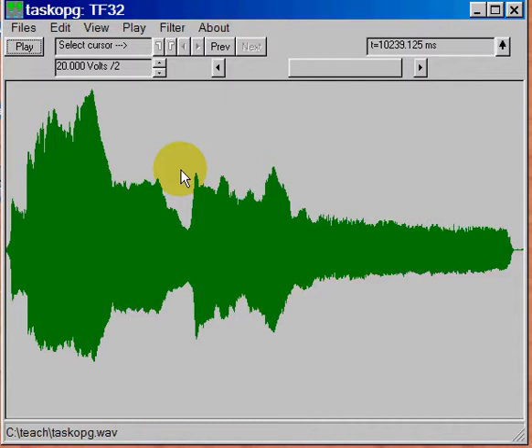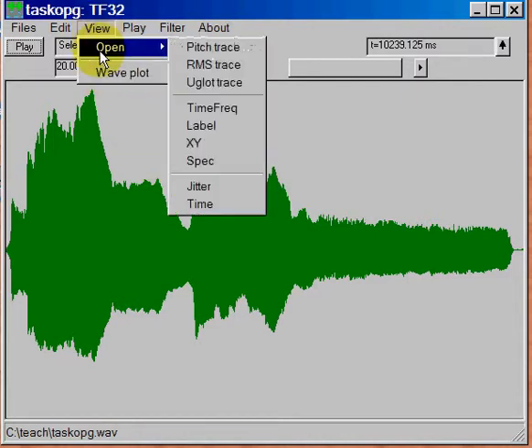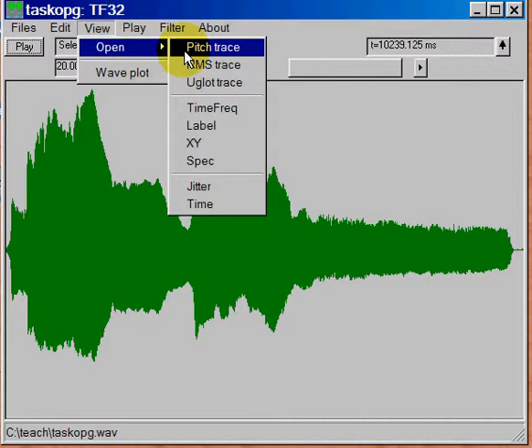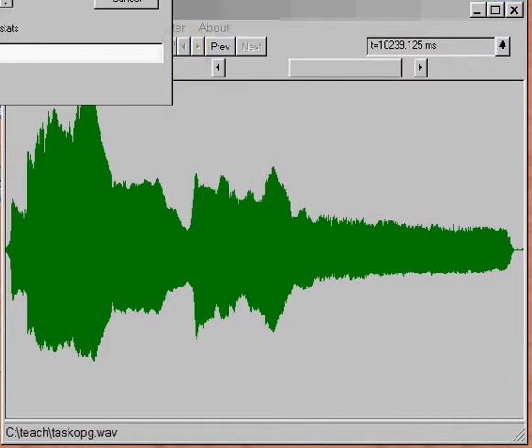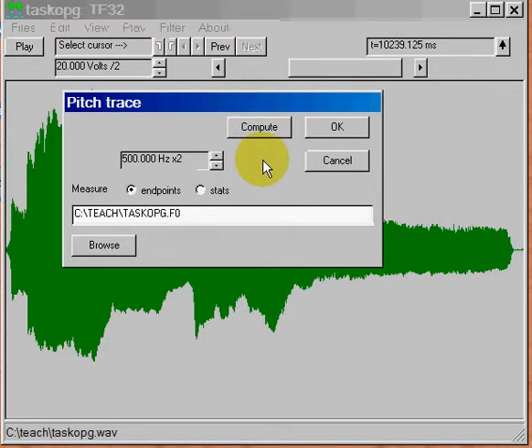And what we need now to do is to open up another window and that window will provide the fundamental frequency trace. So if you go up to the view open window and it's called pitch trace in the drop down menu. Click on that. And you should get a window that looks something like this.